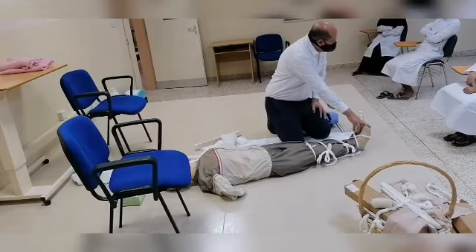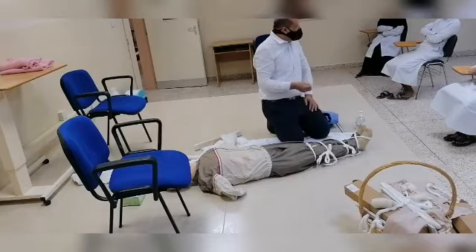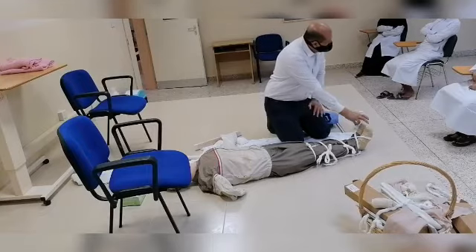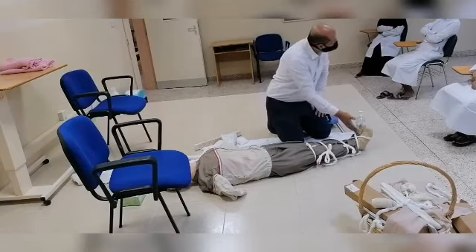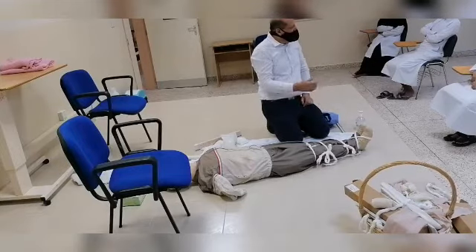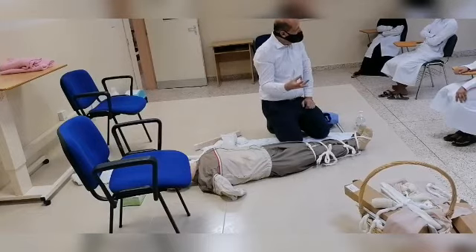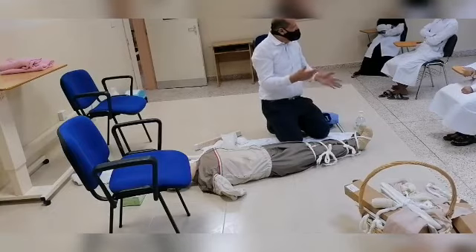I also have to check for circulation — ask if the patient has numbness. If he is not wearing shoes, I can check the toenails: if they are pale or becoming bluish, that indicates discoloration or cyanosis. I can also check movement, asking if he is able to move his toes. This is how I ensure there is no interference with circulation. Those are the three ways of fixing a fracture: soft splint, hard splint, or anatomical splint — or we can use both together.